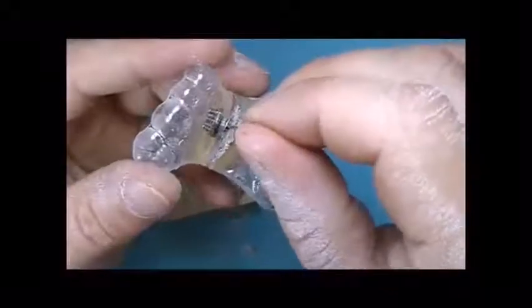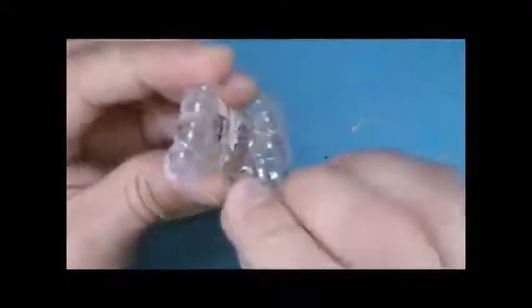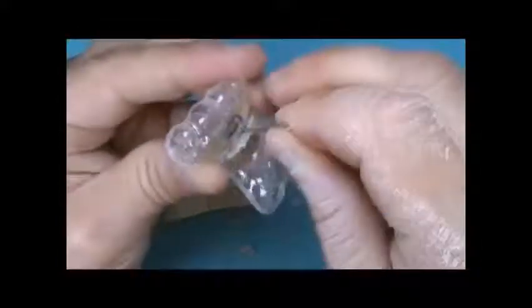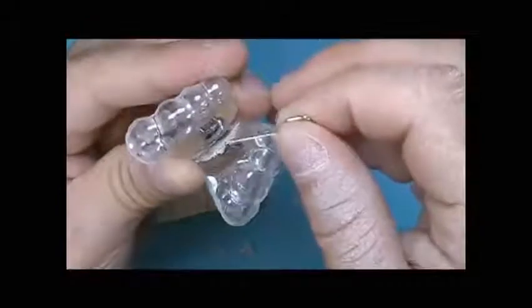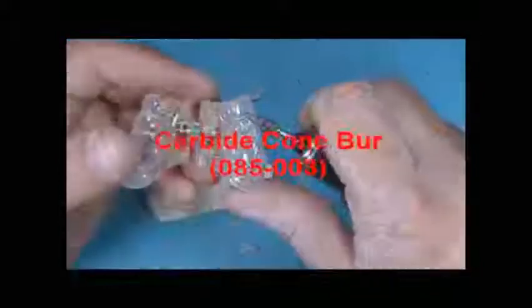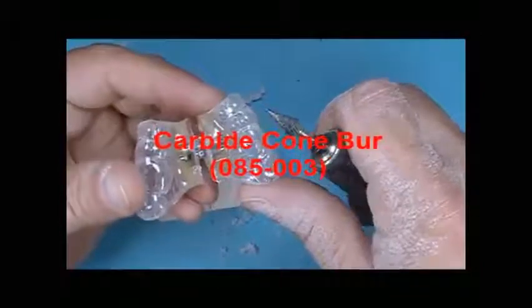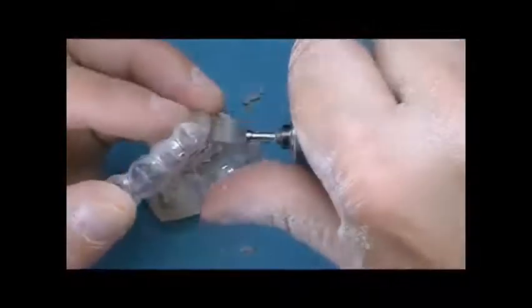Insert the expansion screw key into the screw hole and activate towards back of appliance following arrow on screw body. Incorporate about 10 activations to open center cut. Using the carbide cone burr, blend and round center cut. Appliance will be finished with screw in open position.